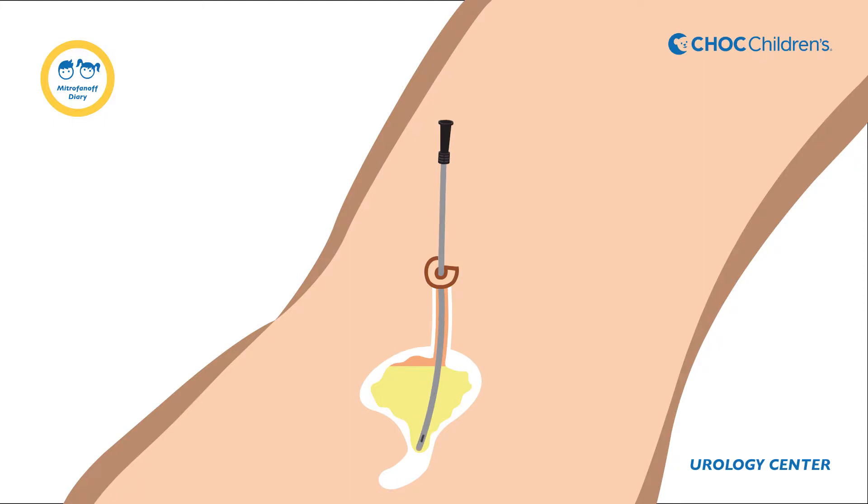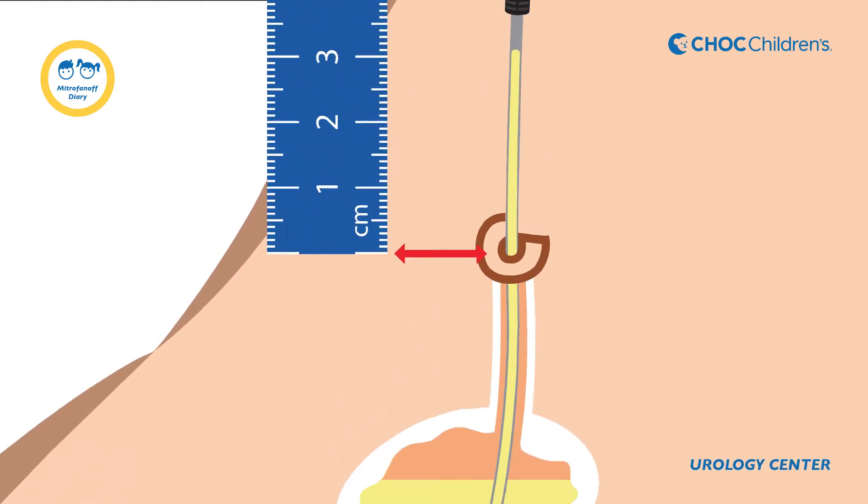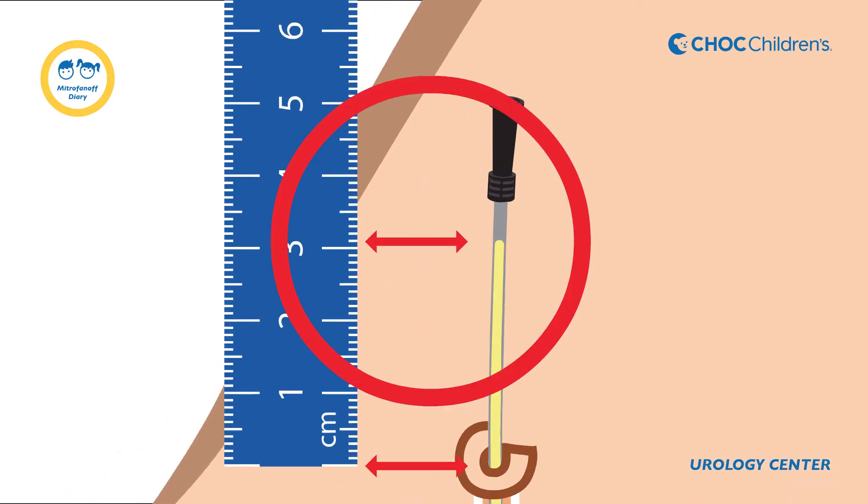Keep the end of the catheter pointing straight upwards. Urine will start draining from the bladder and stop at a certain level. Place the ruler where the catheter enters the body and measure the urine height in centimeters. This is the bladder pressure.